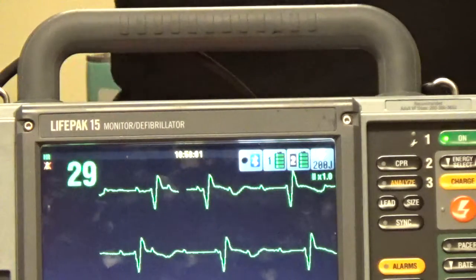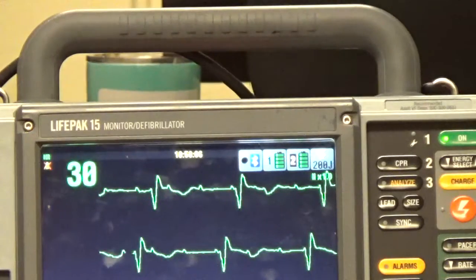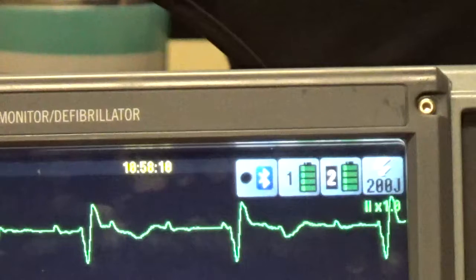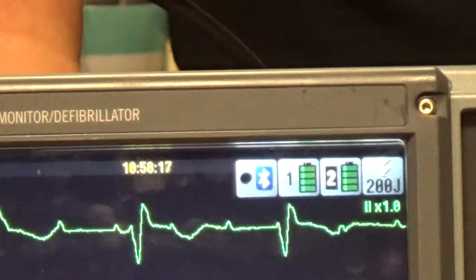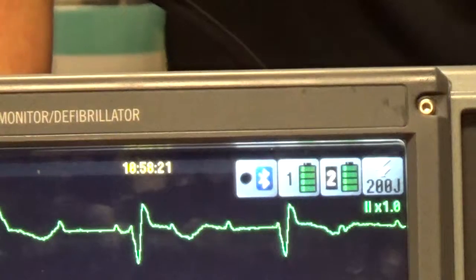Usually with your third degree heart blocks, you can see your QRSs widen out a little bit, but notice the main thing about it: is there a QRS for every P wave on that monitor? There's not. Remember, it's a complete dissociation. SA node, AV node, and down have no correlation with each other.